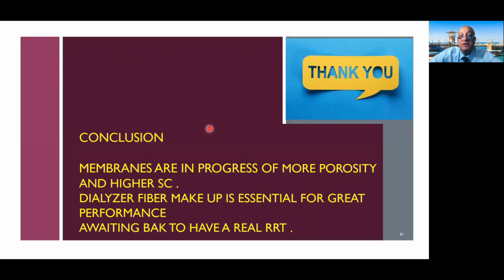So, Mr. Chairman and dear colleagues, in my conclusion, membranes are progressing toward more porosity and higher sieving coefficient. Dialyzer fiber makeup is essential for great performance, and we are all awaiting the magic solution of the bioartificial kidney to have a real renal replacement therapy.